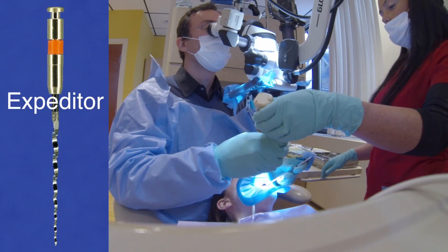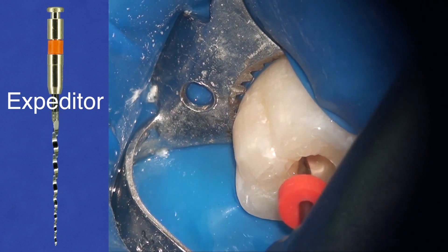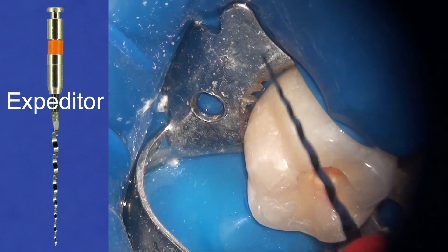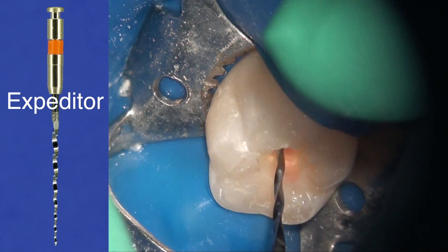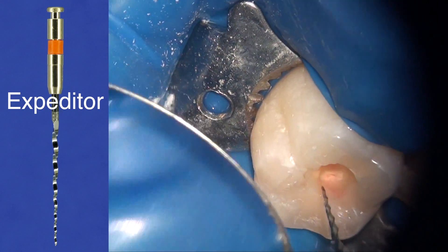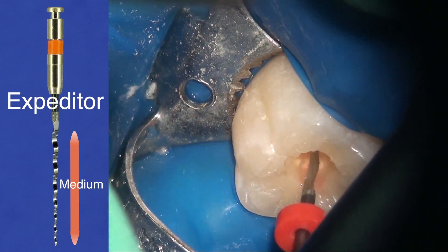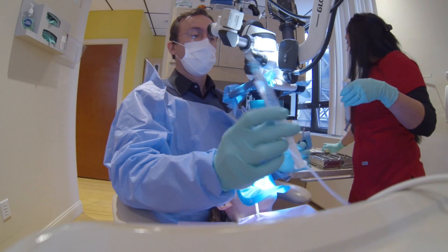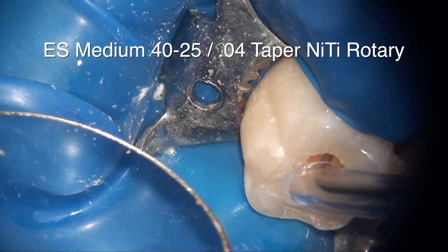I'm now using the expediter file. The expediter file is the first file in the EndoSequence technique — it's the screening file that tells you which package of files to open. If you don't remember this step, please go back and watch case-based learning module one. Because the expediter file goes in a good three-quarters of the way, we're dealing with a medium package of files, which is sizes 40 through 25.